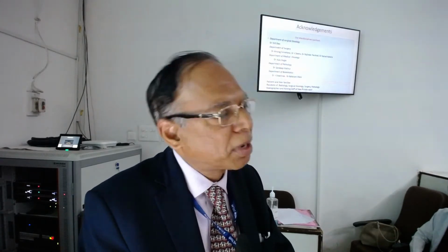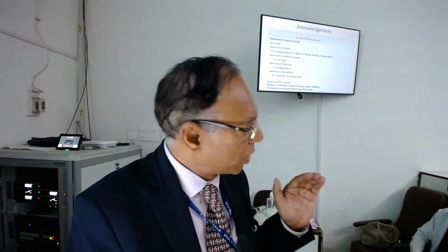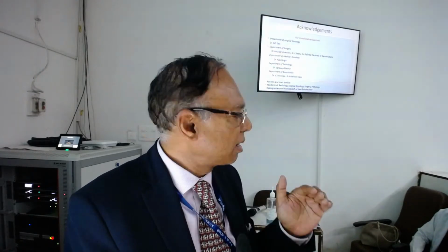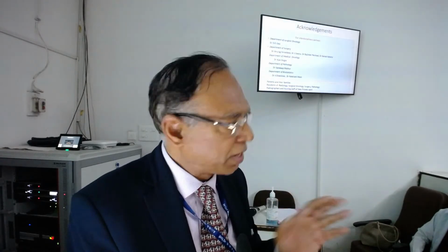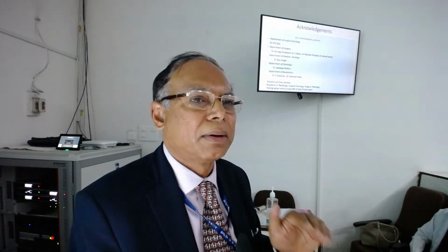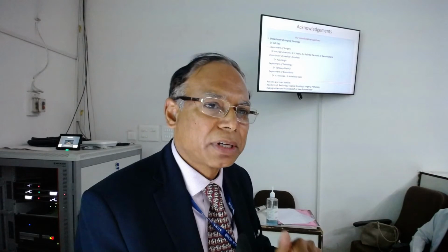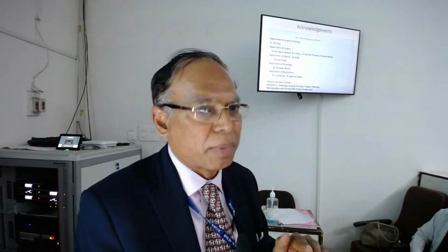And there is some confusion about the cutoff age and other parameters for diagnostic mammography versus screening mammography. People get confused between the two. So again, this needs to be clarified. Screening mammography is not being used by the population-based screening for breast cancer in India, which is launched by National Health Mission, NHM. So we are using only clinical breast examination, and mammography is being used only for high risk category, but not for national screening.